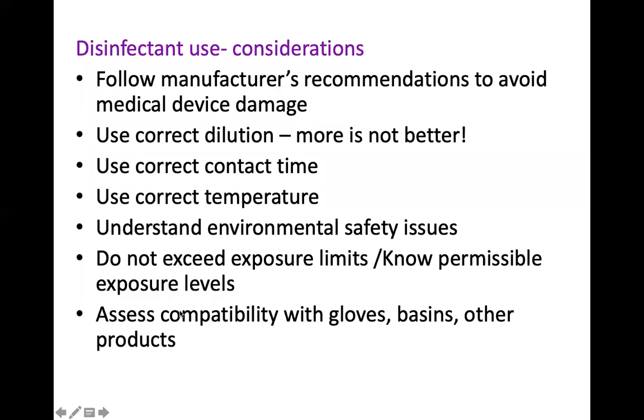Understand environmental safety issues. For the operators, the people using them to carry out this process, what is the exposure limit? You need to know the permissible exposure levels. And if there's a breach in that permissible exposure level, or somebody has been exposed inappropriately, for example, there's a splash, what do you need to do in terms of safety and in terms of treatment? Because now that would be chemical poisoning, all right? Assess compatibility. Again, that is information that you'd get from the manufacturer.